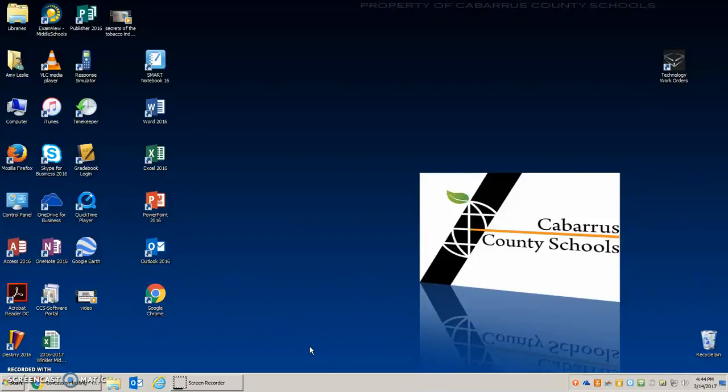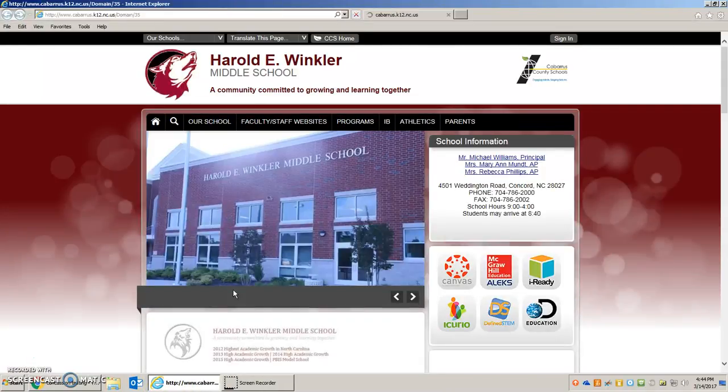This is the instructional video for baseline concussion testing for Winkler Middle School athletics. Everyone who is a new student athlete at Winkler Middle School must take the baseline ImPACT concussion test, meaning once you take it while at Winkler, you do not have to take it again for each season that you play. First and foremost, make sure you use Internet Explorer for our testing.